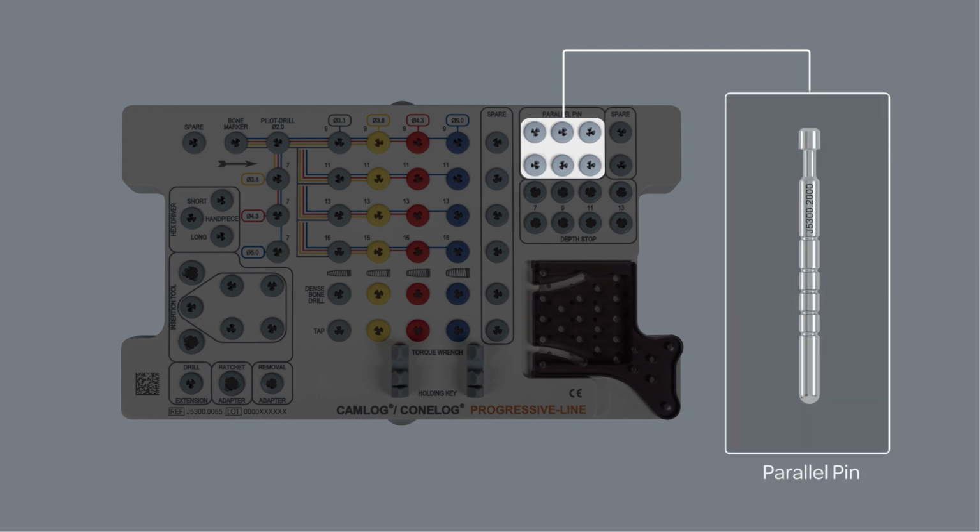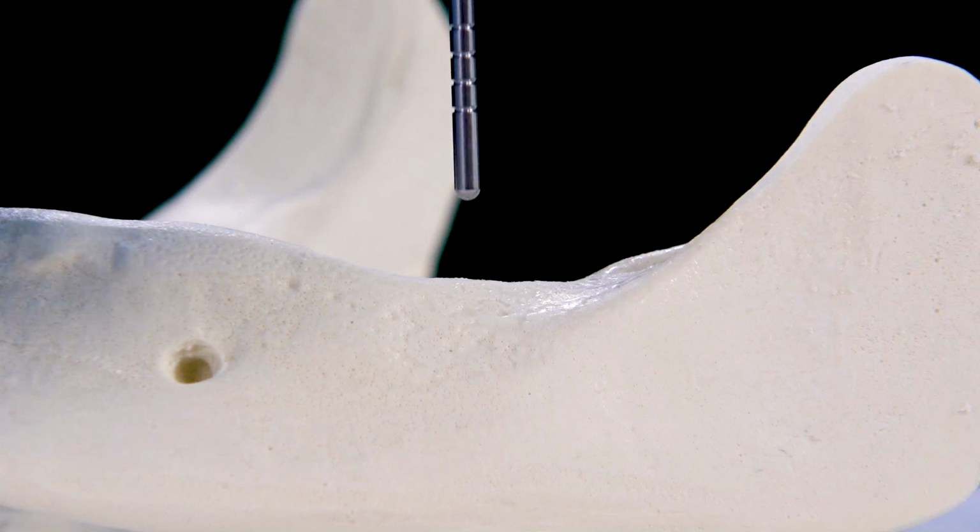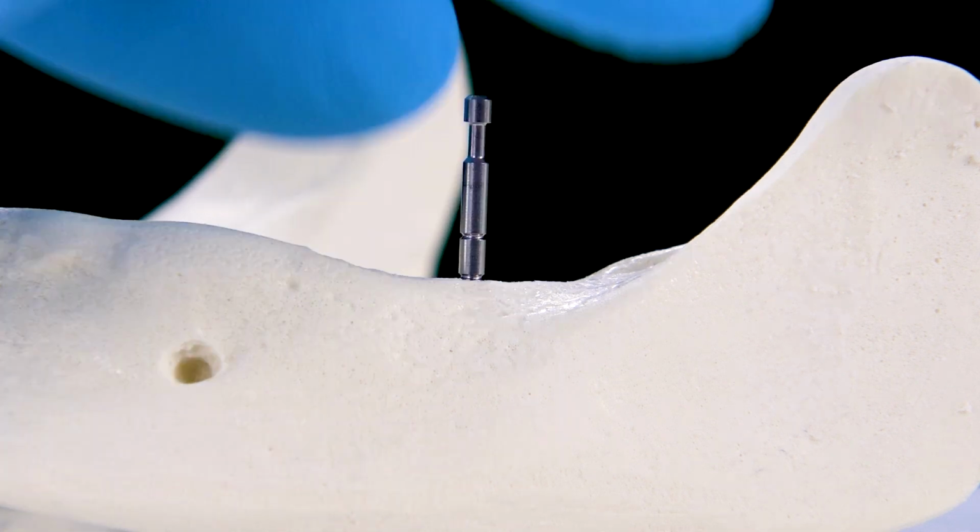Once drilling is complete, the depth and axis of the implant bed is checked using the paralleling pins with depth marks.